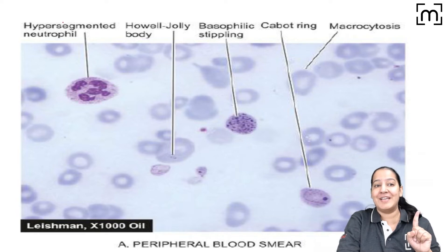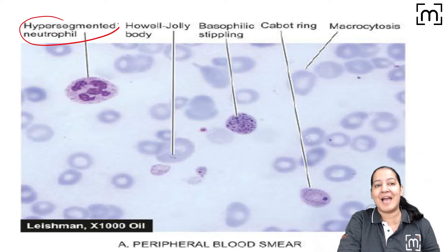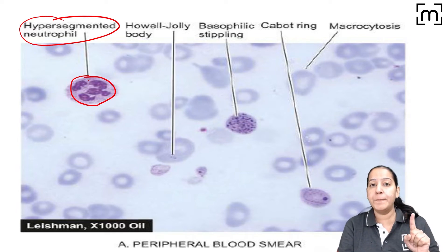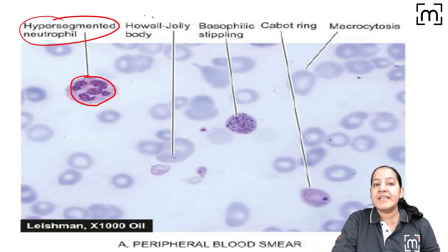The most important and the hallmark feature is the hypersegmented neutrophil. Here you can see a neutrophil having the lobes equal to 5 or more than 5.